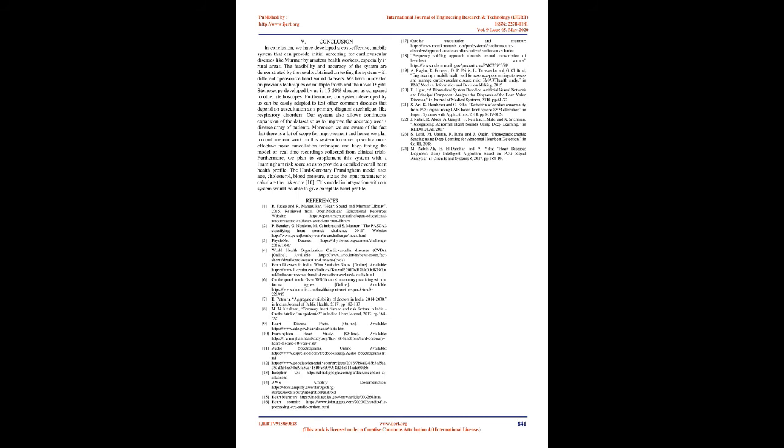Combining PASCAL datasets A and B with the University of Michigan dataset, the training set contained 314 images and the validation set contained 70 images. After 20 epochs, validation accuracy equals 97.14%. Experiment 3: PhysioNet dataset. It had 3,216 audio files in the training set.